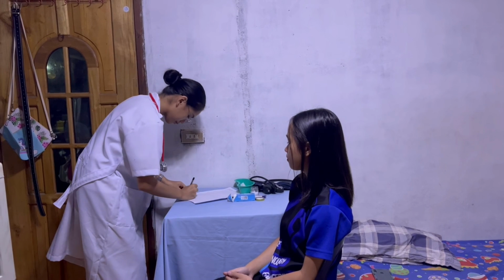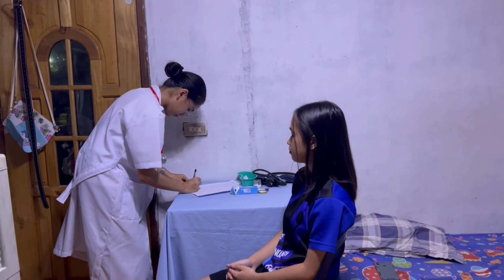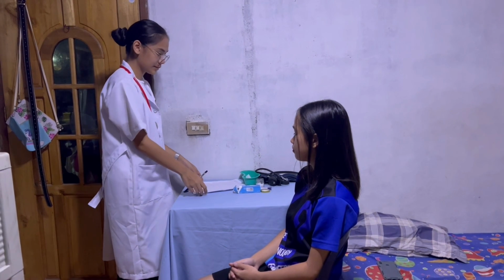For the documentation, record the blood pressure measurement in the vital sign monitoring sheet and report any significant changes in the blood pressure reading.